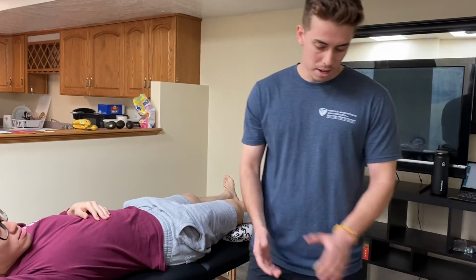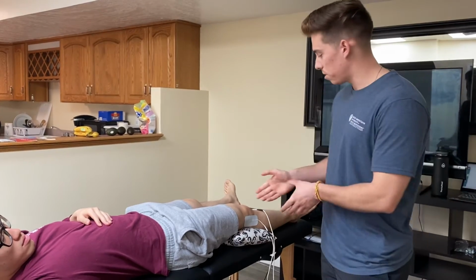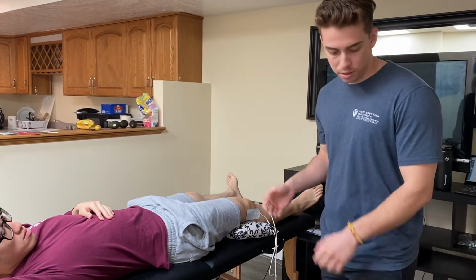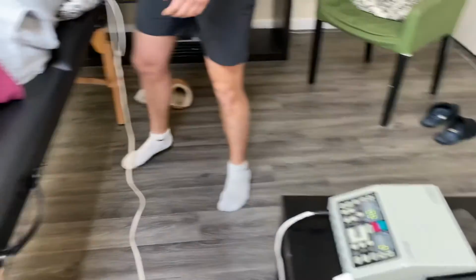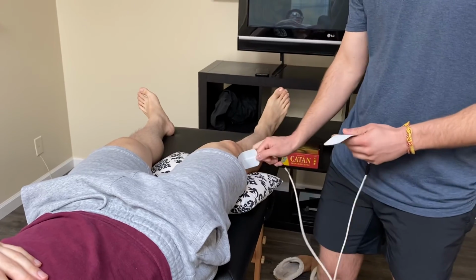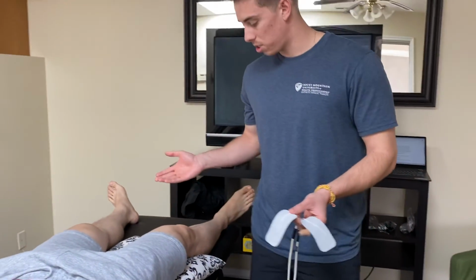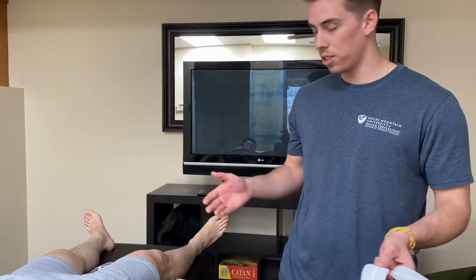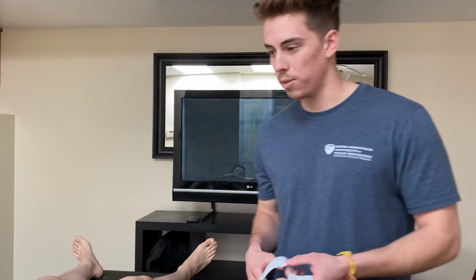Cool. So basically, that's the procedure for TENS. After this, we would take them off. Let's demonstrate that. We just stop the machine here. Then we'd take off the pads from the knee, making sure that there hasn't been any damage to the skin or anything like that. And he looks great here. After this, we could either send him home or continue with the treatment, whatever we're doing for that day. So thank you.